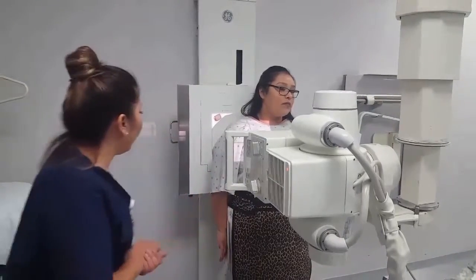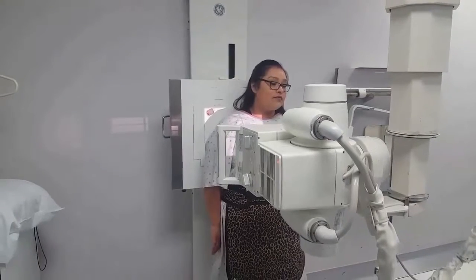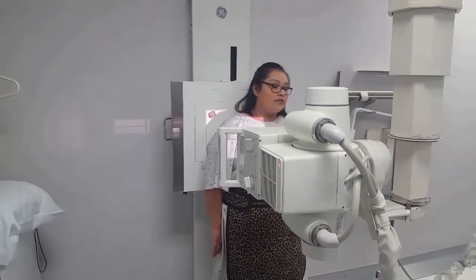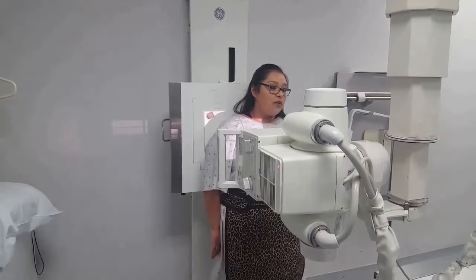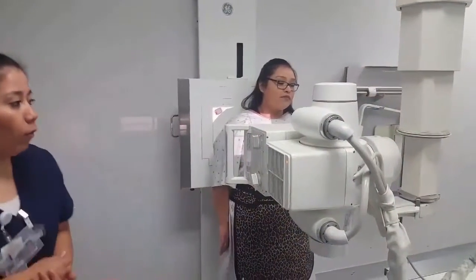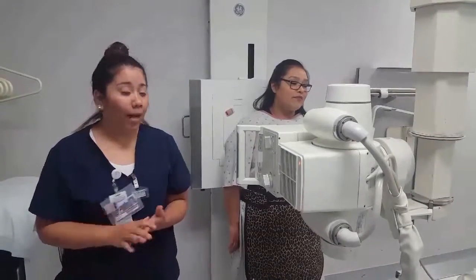Okay, ma'am. So just go ahead and follow my breathing instructions. Stay still, don't move. Okay. Take a deep breath in and hold it. Breathe, x-ray. You can breathe now. So my technique for this first projection was 85 kVp at 10 mAs.